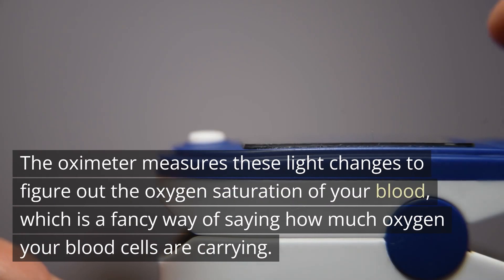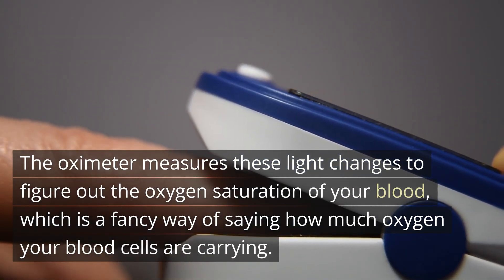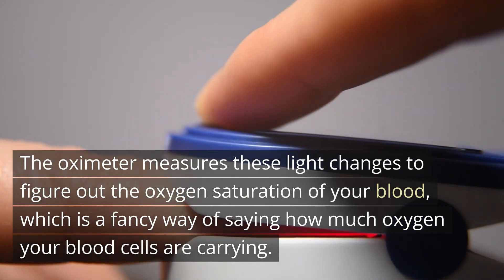The oximeter measures these light changes to figure out the oxygen saturation of your blood, which is a fancy way of saying how much oxygen your blood cells are carrying.